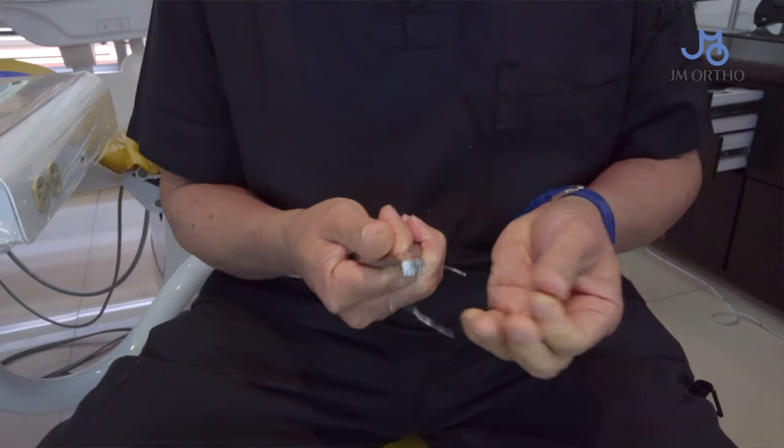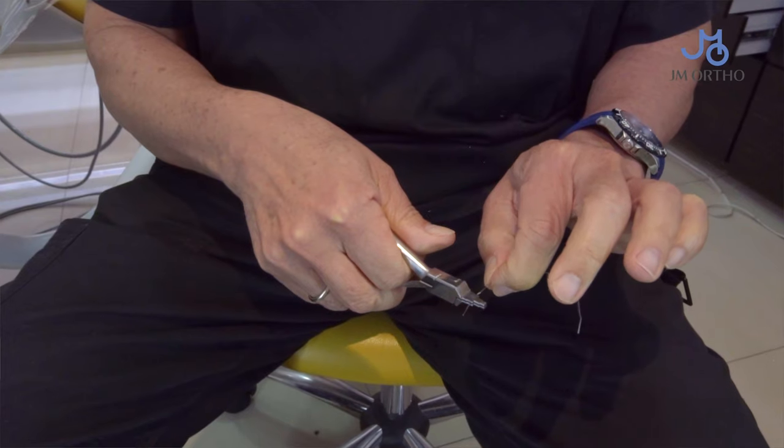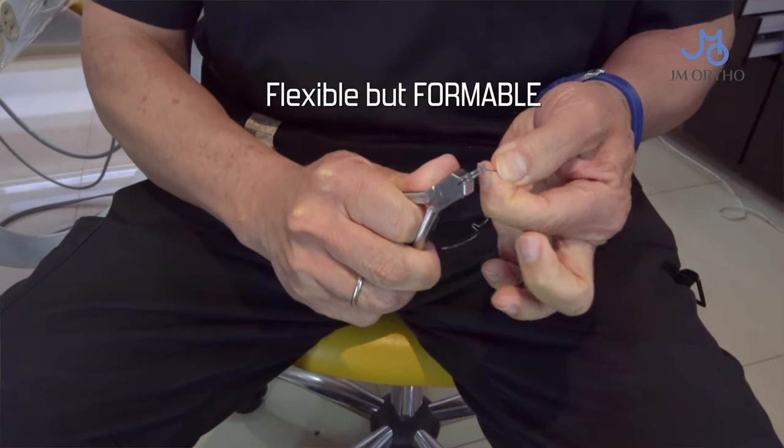You can bend it. It's also got super-plasticity. It means flexible but formable.